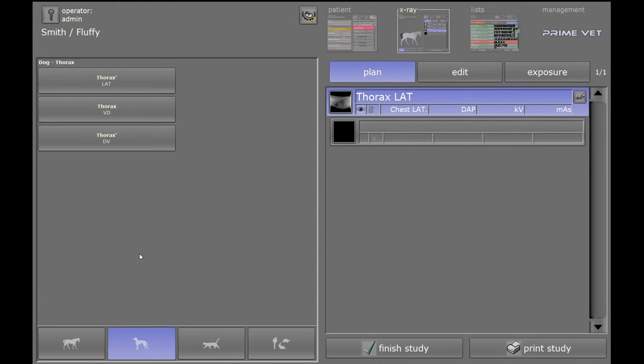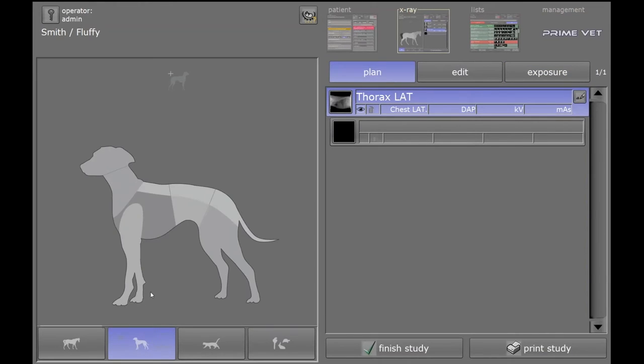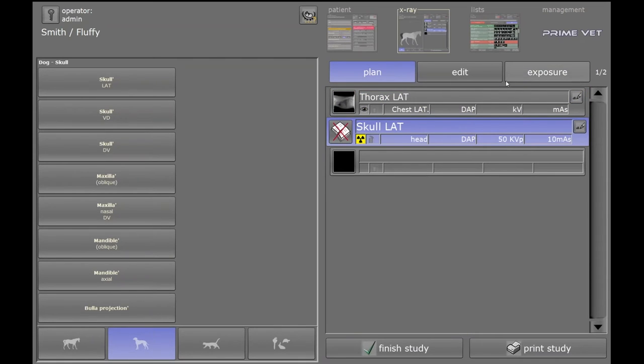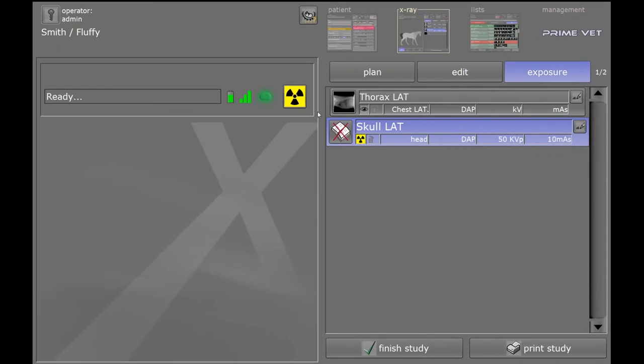If I go to Plan, I can go ahead and add another view if need be.